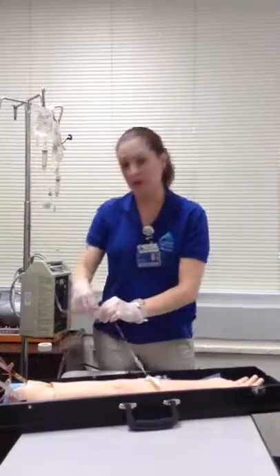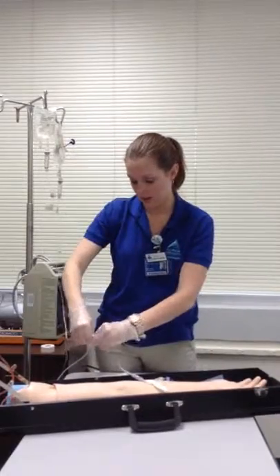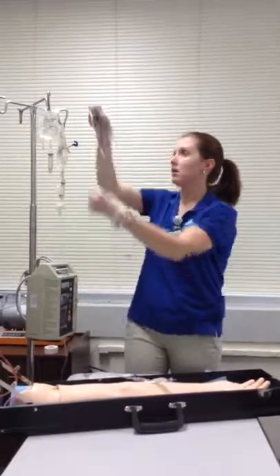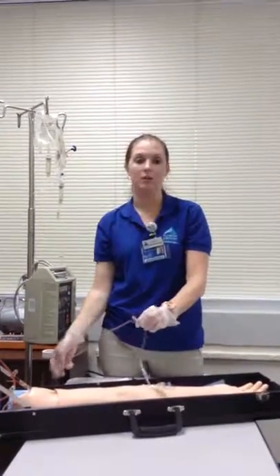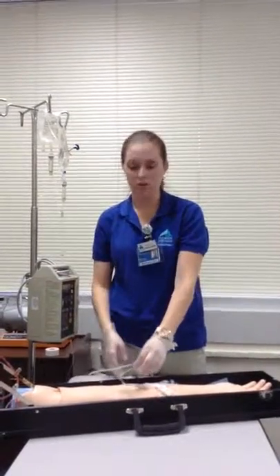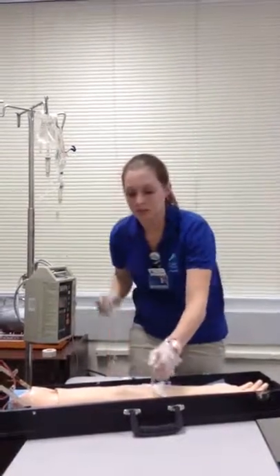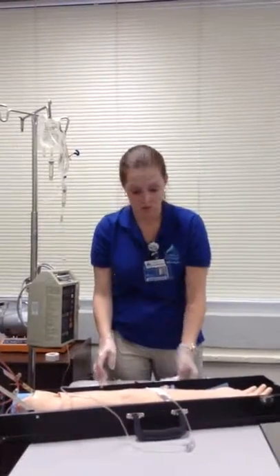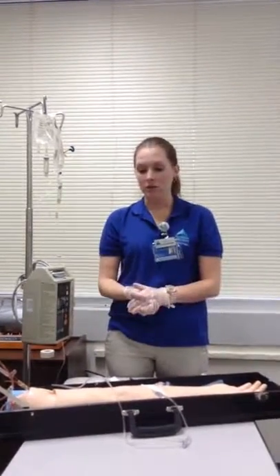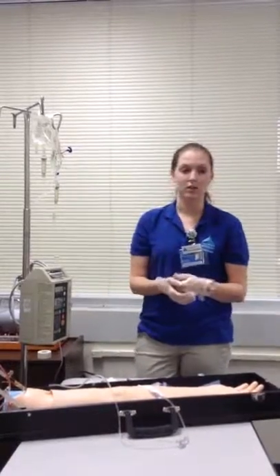And I would disconnect the piggyback, and at this point I can add an alligator clamp for later use, and then I would ask the patient how she's feeling, and I would also clean my area, dispose of any trash and anything that needs to go into the sharps container. Ms. Jones, how are you feeling? I'm feeling great. All right, thanks, and we'll be back later to check on you, and that's it.